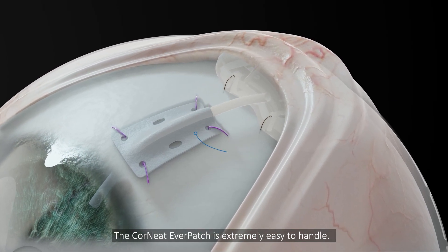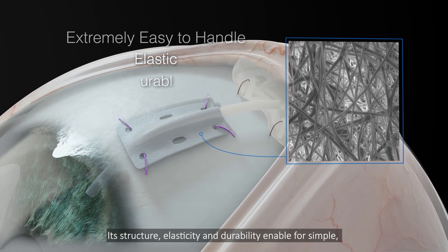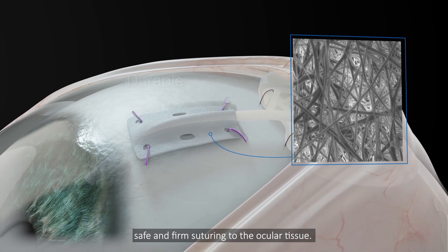The CorNeat EverPatch is extremely easy to handle. Its structure, elasticity, and durability enable simple, safe, and firm suturing to the ocular tissue.